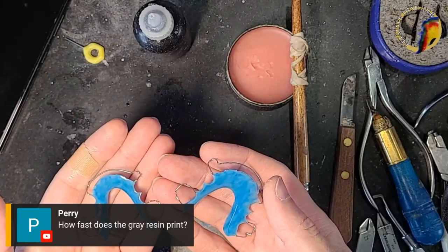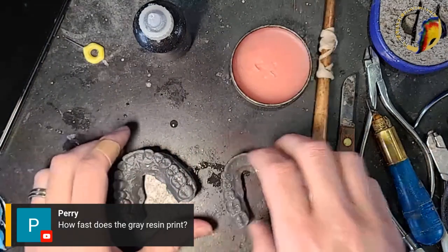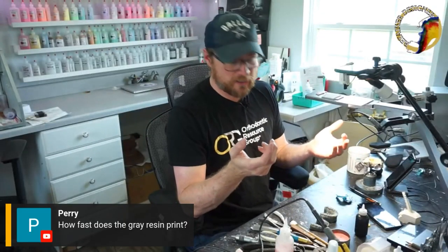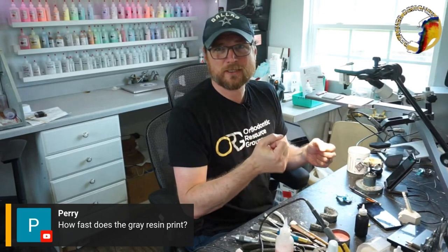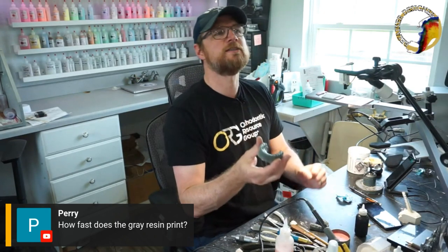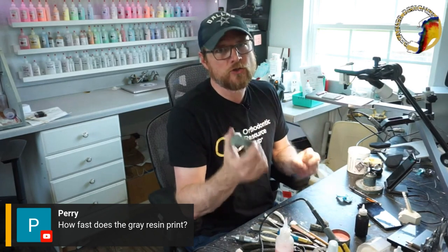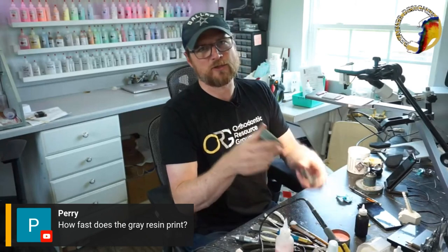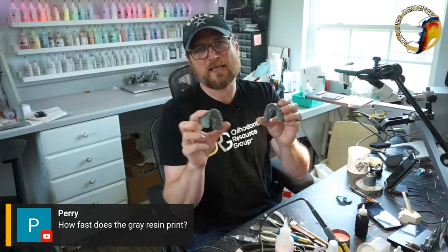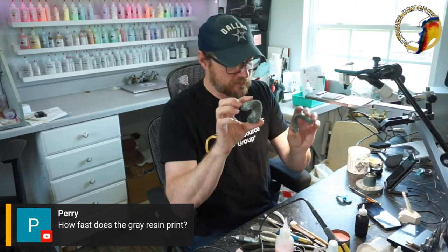We got a comment from Harry: 'How does the gray resin print?' This is draft resin. Draft resin does a pretty good job printing — it does it faster than gray. Draft is a little more brittle but it prints twice as fast. These two would take an hour to an hour and a half on draft, but two to three hours in gray. Gray does print really well and is a little tougher, but draft is more brittle.